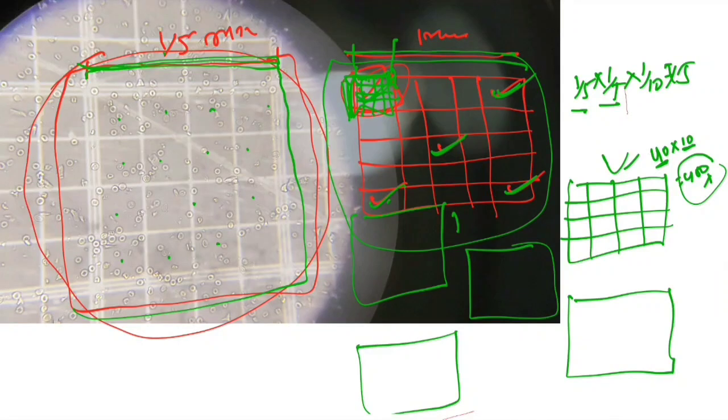So here one most important thing about the triple line is very, very important. So we have triple line here, here, here and here. Okay, so triple line, middle line should be the reference line. I am telling you the middle line should be the reference line, and upper and left, any cell touching the upper and left middle line, we will consider the cell inside the box. Okay, and with the same formula, if the cell is touching the middle line to the right and lower, then we will consider the cell outside, or we can say next.